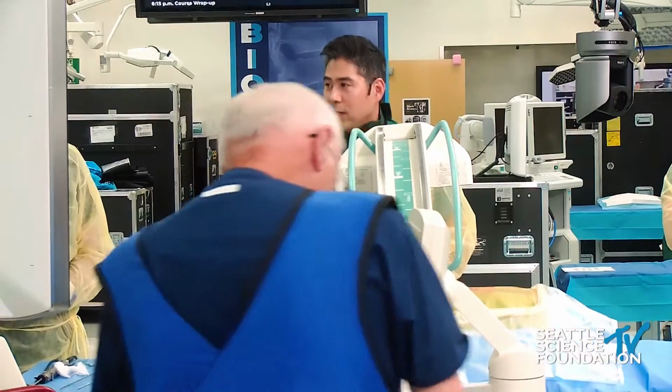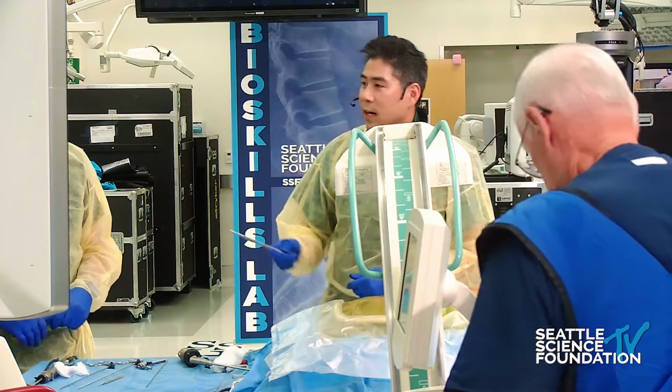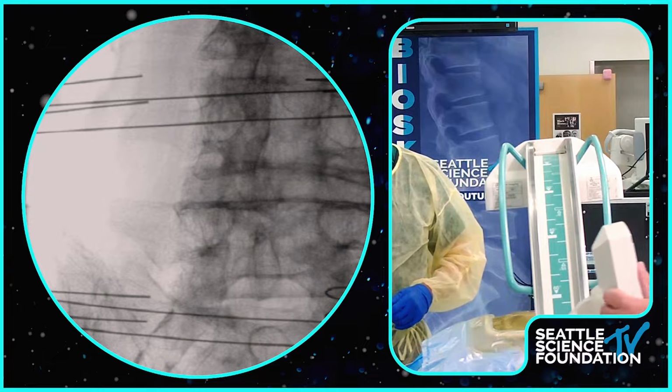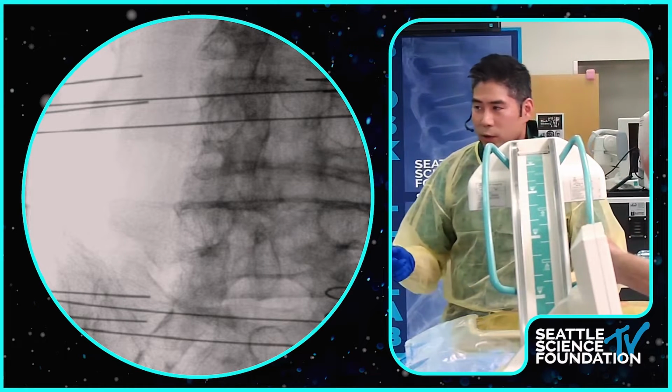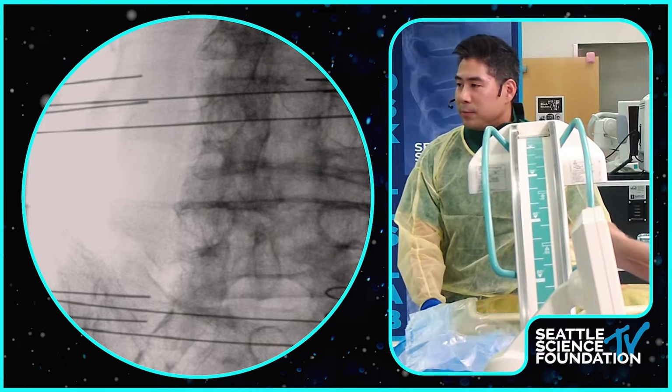I already localized the interlaminar space. May I have the pituitary, please? You can actually see, I don't know if people can see the x-ray, but this is the interlaminar window at L5-S1. It's usually big enough to do a discectomy through without doing any drilling. My goal is to localize that, and I already localized it here. So take a shot right here.